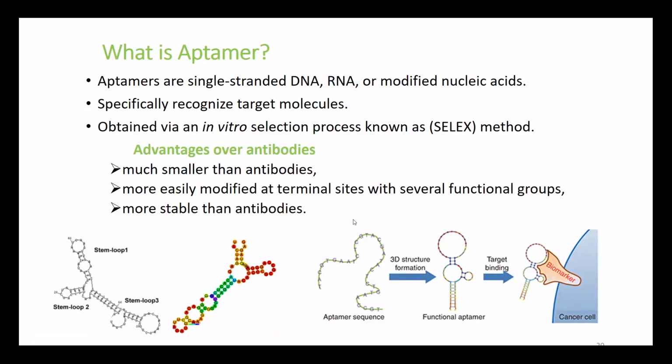But they are much more stable than antibodies because they are DNA. They are just a short single-stranded chain of DNA, and they never denature in any harsh condition.